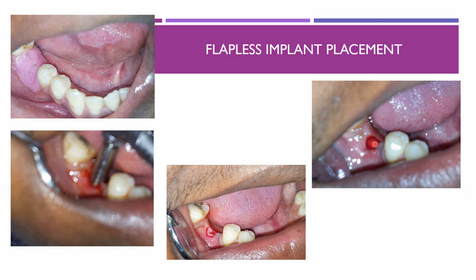So you can start doing the sequential procedures: first the lancet drill and the pilot drill to the desired depth, then the widening of the osteotomy site, and then the implant placement. In the same way as the non-submerged implant, the gingival former will be given, and we will be waiting for a period of time for osseointegration to happen. So that is about the flapless implant.